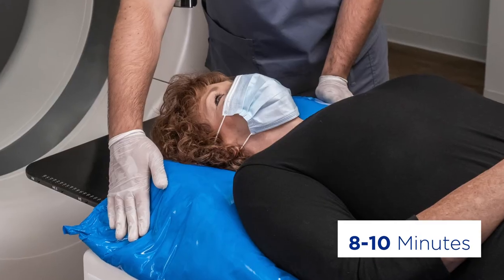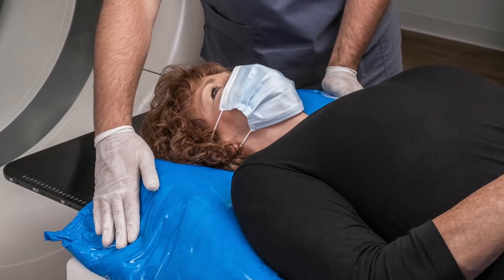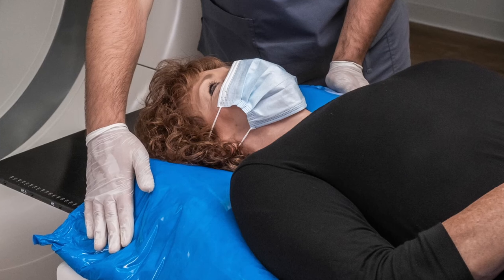The foam takes about 8 or 10 minutes to cure, so make sure your patient remains motionless. Once the foam has fully hardened, your SecureFoam Pouch Pro is ready to use.